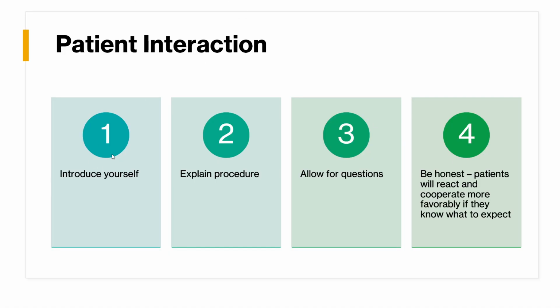So an example of this would be, hi, I'm Dr. Beck. I'm going to be performing a cervical x-ray on you today. What we'll do is we're going to put you in front of this x-ray unit. We're going to take a couple of pictures, and when we're done, we'll be able to send those off to the radiologist for interpretation. I won't be able to give you any of the results today, since I am a radiologic technologist. That'll be out of my scope of practice. But if you have any questions, if anything's uncomfortable, please let me know. Do you have any questions for me? And then they could ask questions.